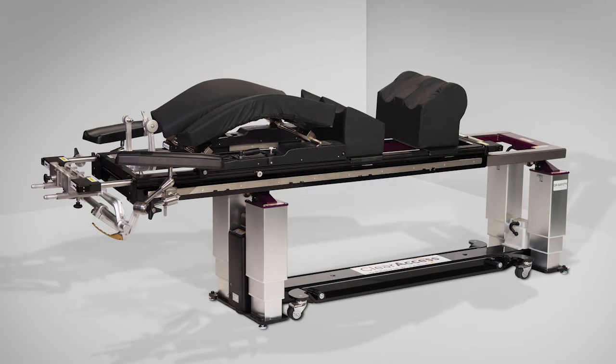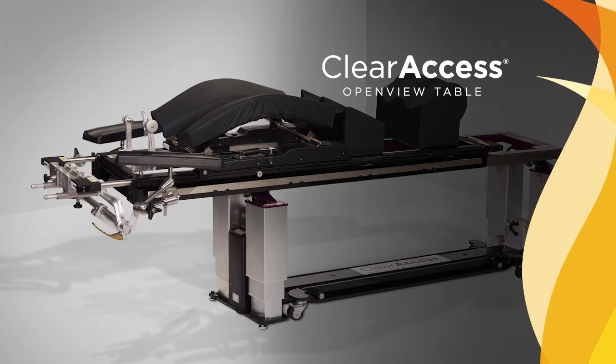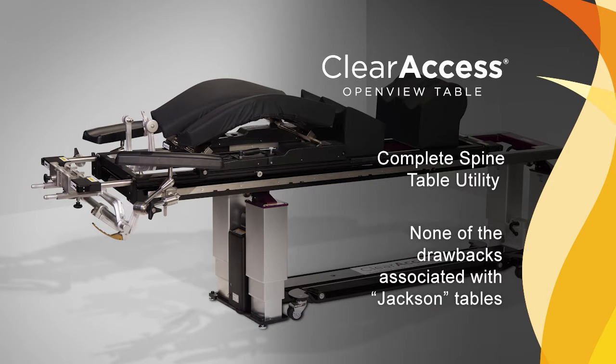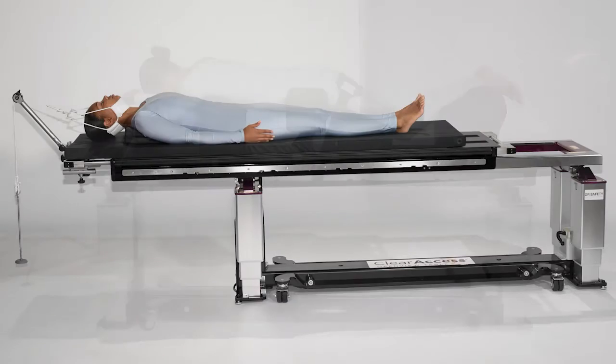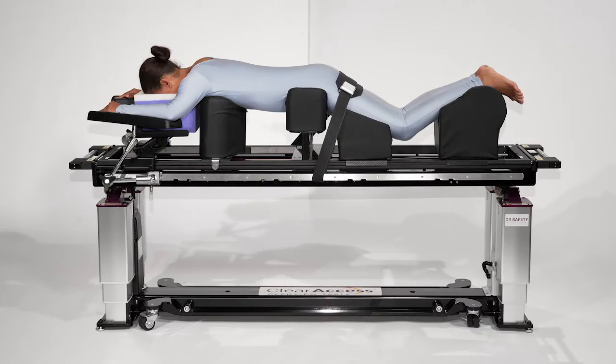The Clear Access Spine Surgery Table by OR Safety was developed to maintain all of the utility of competitive spine tables generically referred to as Jackson tables, while removing all of the notable drawbacks of those types of systems. The table maintains head-to-toe C-arm access for lateral, anterior, and posterior spine procedures.